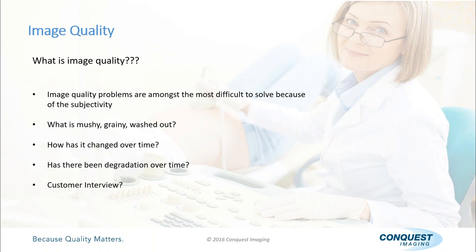How about grainy? How about washed out? So we have a lot of terminology that the technologists will use, but it's really hard to say, okay, I know what you're meaning to tell me. I understand it completely. So one of the things that we have a great deal of difficulty doing is getting a clear picture of what the technologist is trying to say.